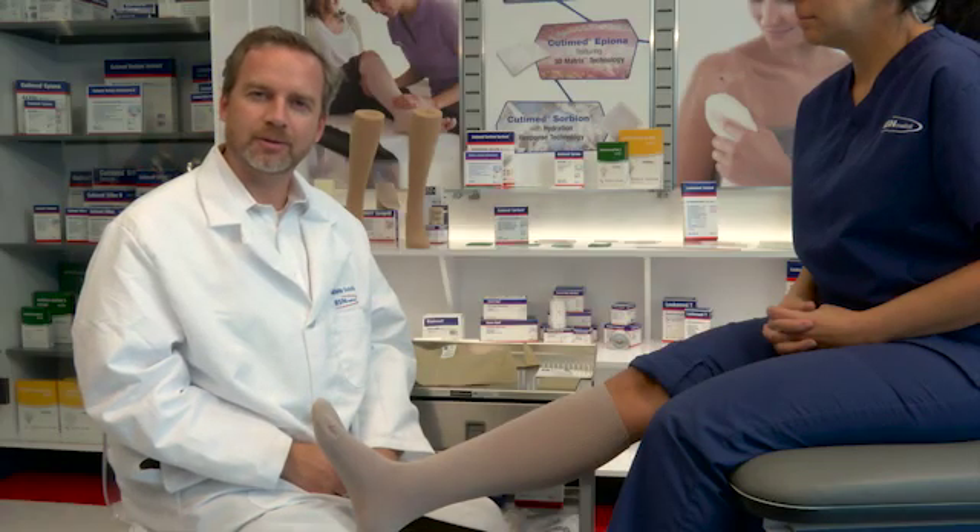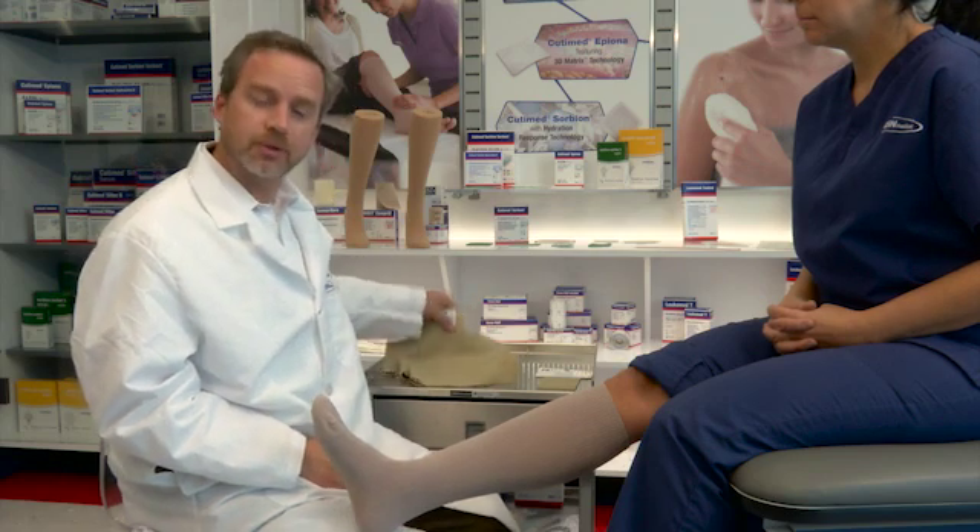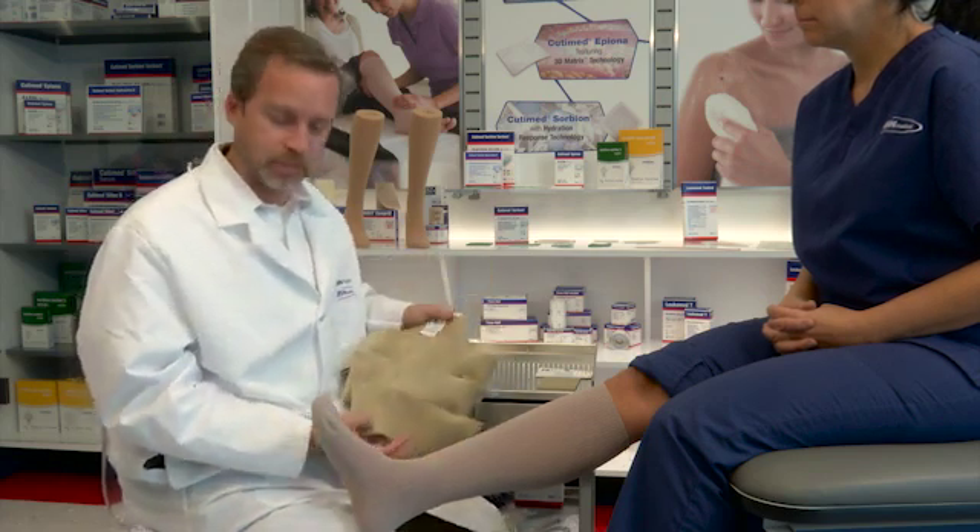Hello, I'm Dr. Wade Farah, medical doctor and a certified wound specialist and inventor of the Farrah Wrap, along with Dr. Barry Creighton, a podiatrist. Today I'd like to show you how to put on the Farrah Wrap Basic.